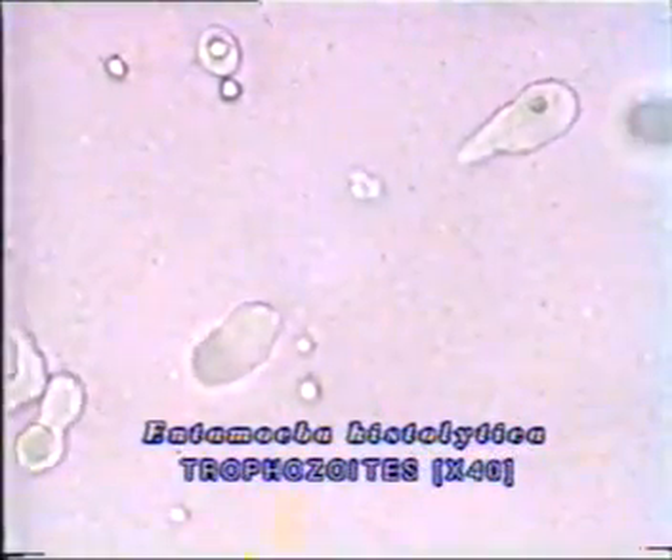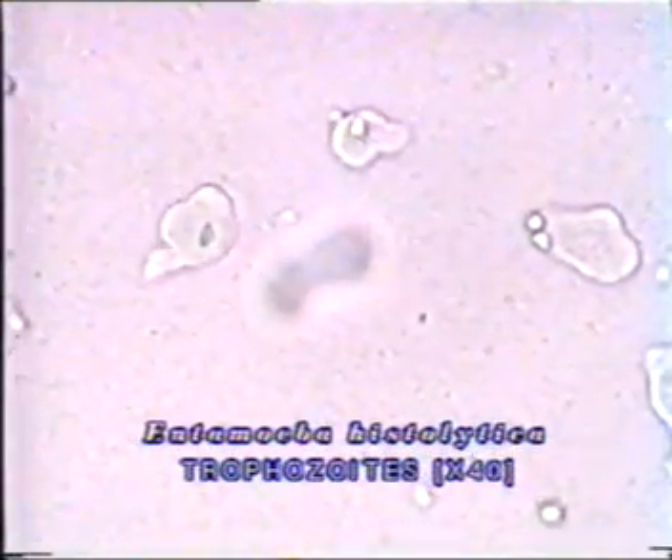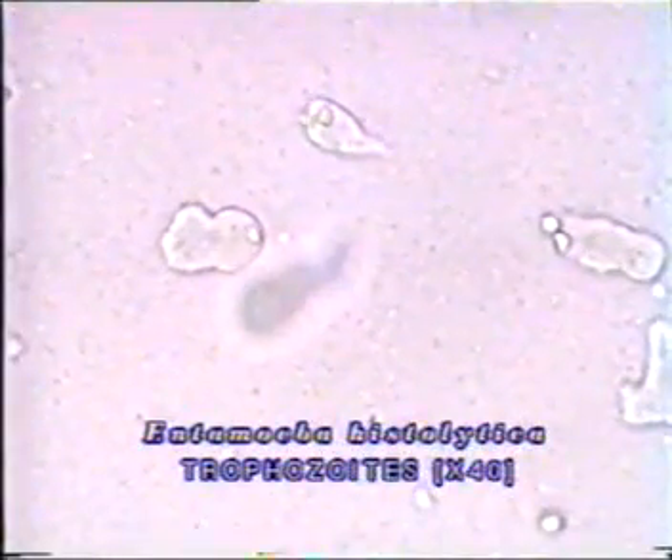Its size is approximately 12 to 35 micrometers. Note the motility, which is usually unidirectional. Note the clear ectoplasm and granular endoplasm. Inclusion bodies may be seen.